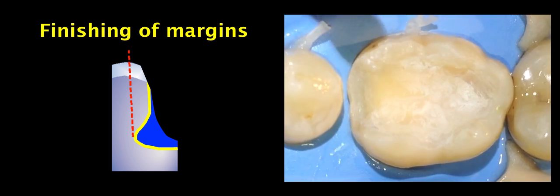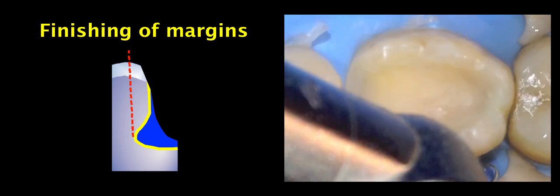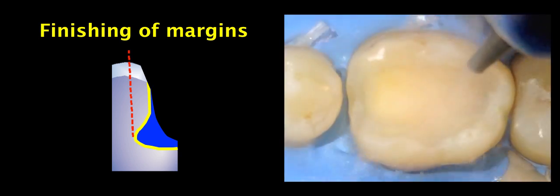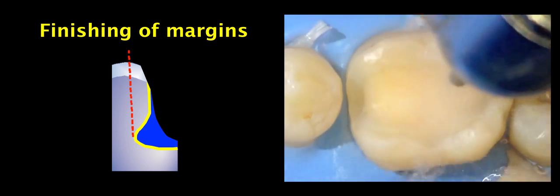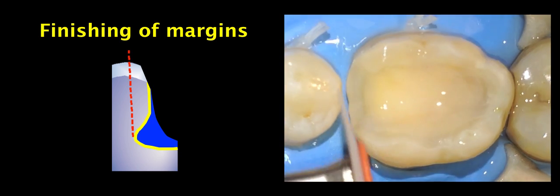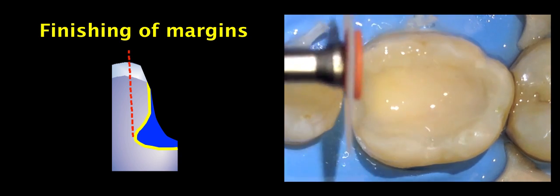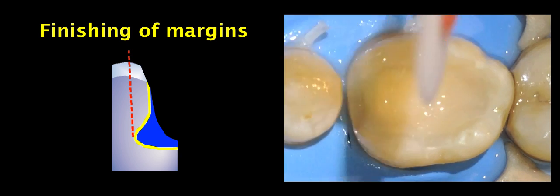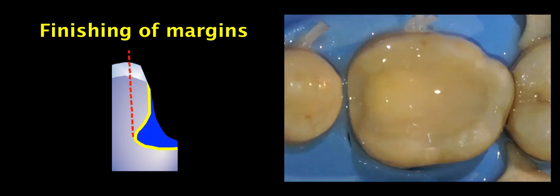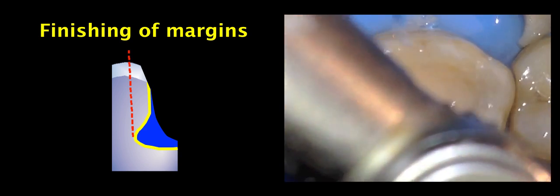You cannot observe very well in the video what is being done but you have the feeling of the margin and you just follow the margin. You don't need to prepare any special geometry, we just want to clean the margin and make a 5 or 10 degrees maximum angle, make sure that we remove all the unsupported enamel and everything is clean. We can use again the ultrasonic instrument and perfectly clean the margin at the proximal box where we have enamel margins.